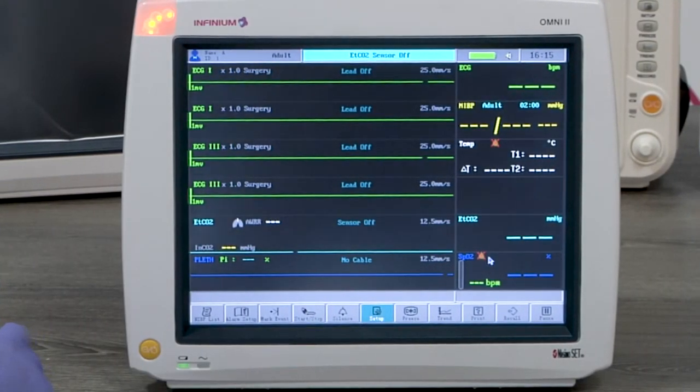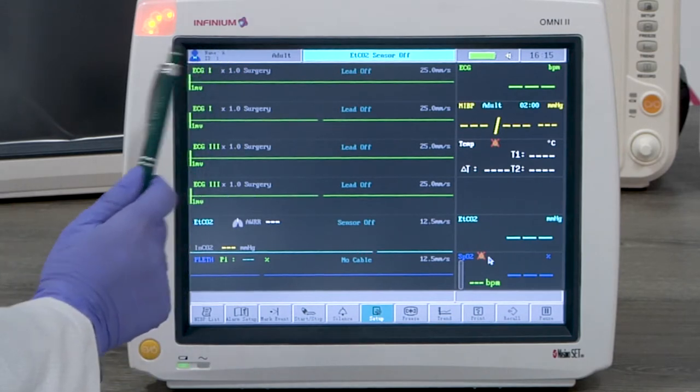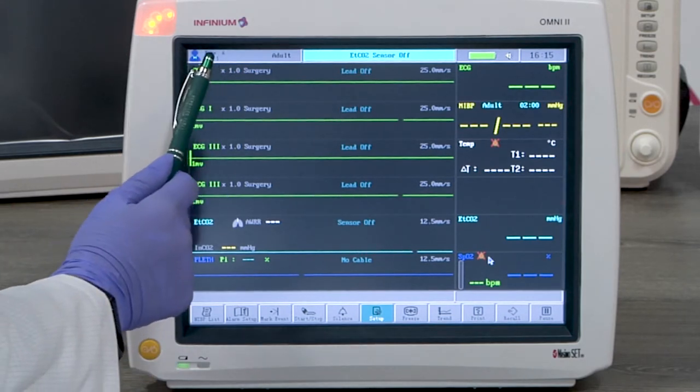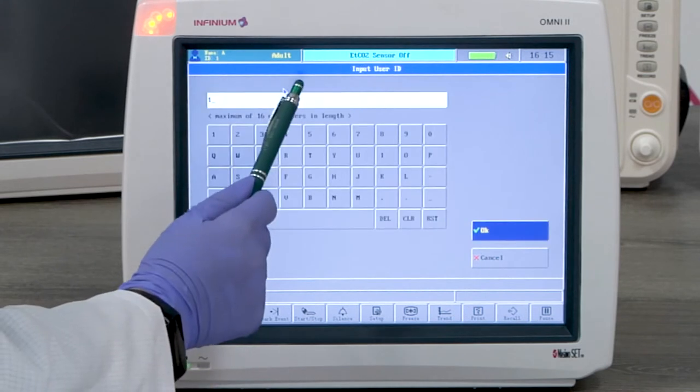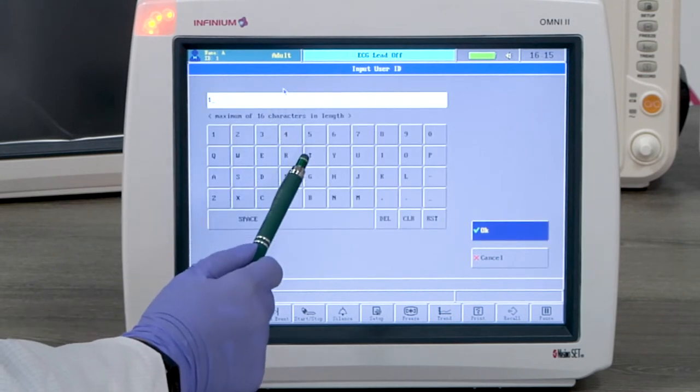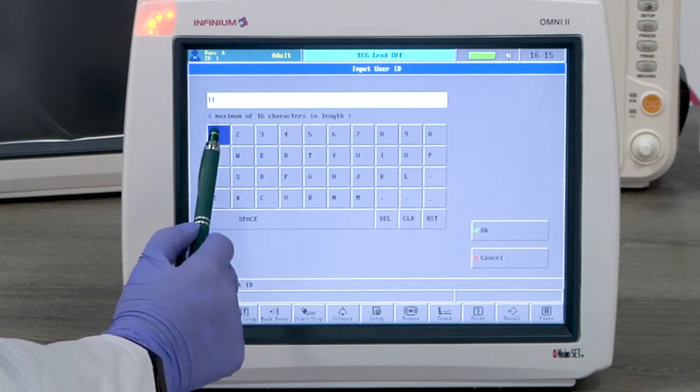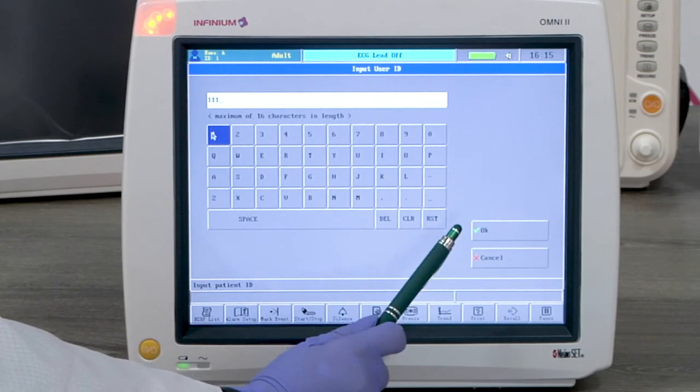Patient ID is required for the monitor to store patient data. By tapping on the top left corner you will enter the patient info setup menu. Here you can set up the patient info accordingly.